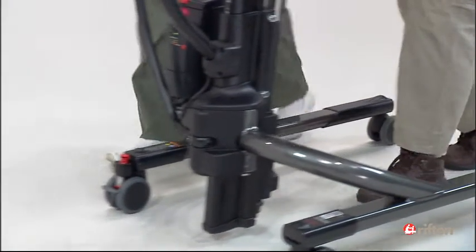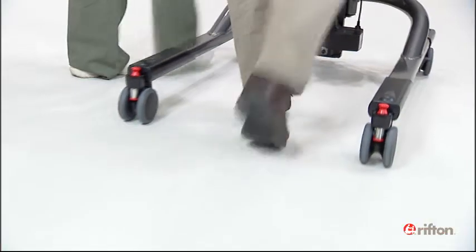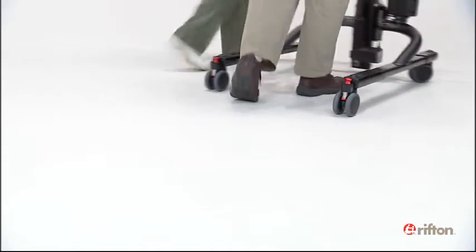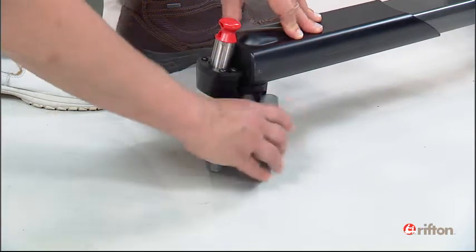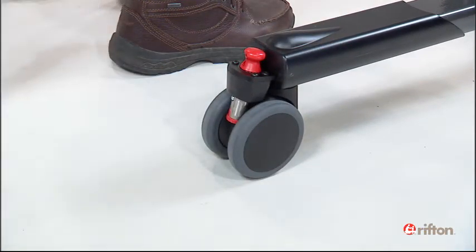Caster direction locks allow you to control the tram's movement in several ways. The direction locks are installed on the casters easily with no tools. They can be removed and installed on a different caster in seconds. Once installed, engage the lock by pressing down on the red plunger.